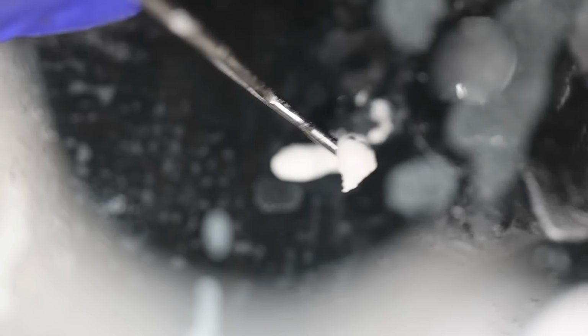You can prefer taking it with the help of a condenser. Just take this much consistency and place it into the cavity. So we will just use this consistency.